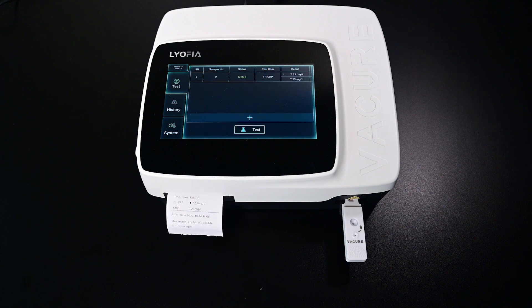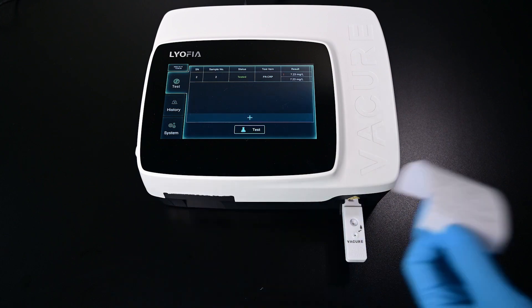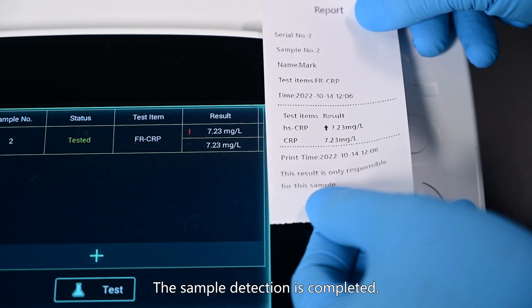The results are displayed and printed. The sample detection is completed.